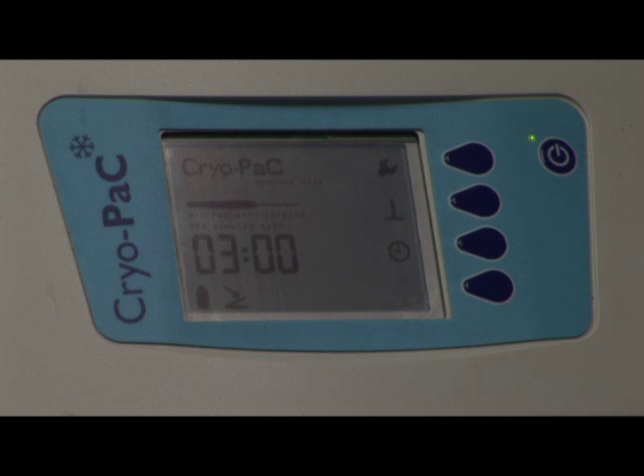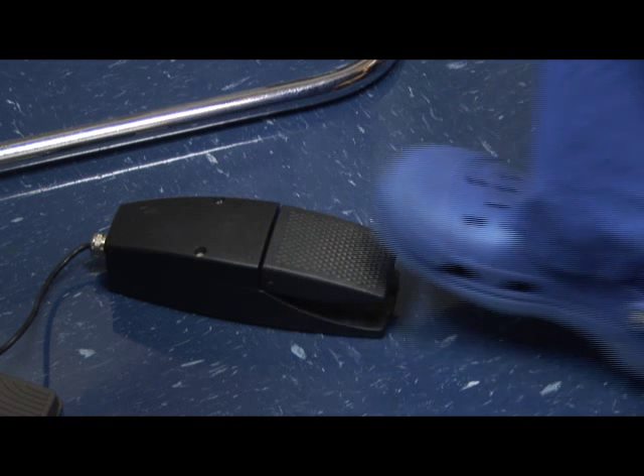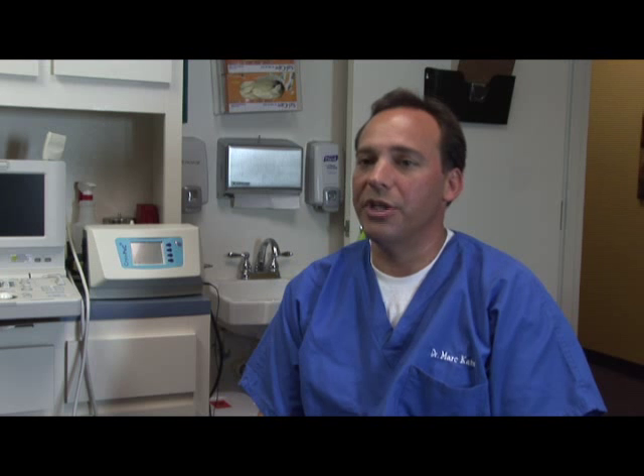We're going to do a three-minute freeze with the cryoprobe, and then we're going to discontinue using the probe by taking our foot off of the pedal, and we're going to do a 30-second thaw. The thaw is actually when you have nerve death, and the nerves have cells within them. They form ice crystals within the cells, and as it defrosts, you'll then have bursting of the cells and death of the nerve.